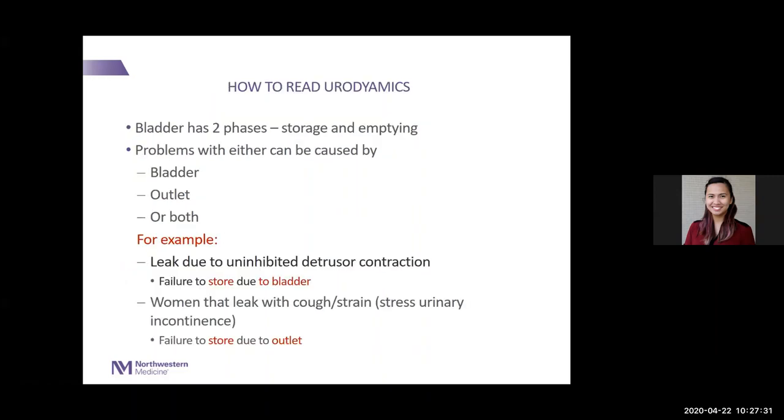They're going to work together. Okay, so I think one of the things that Dr. Wein brought to urology was simplifying urodynamics for all of us that are doing ways that are simple and whose brains can understand this. So when you first look at a tracing, sometimes you're like, what is going on? So you really want to think about it.